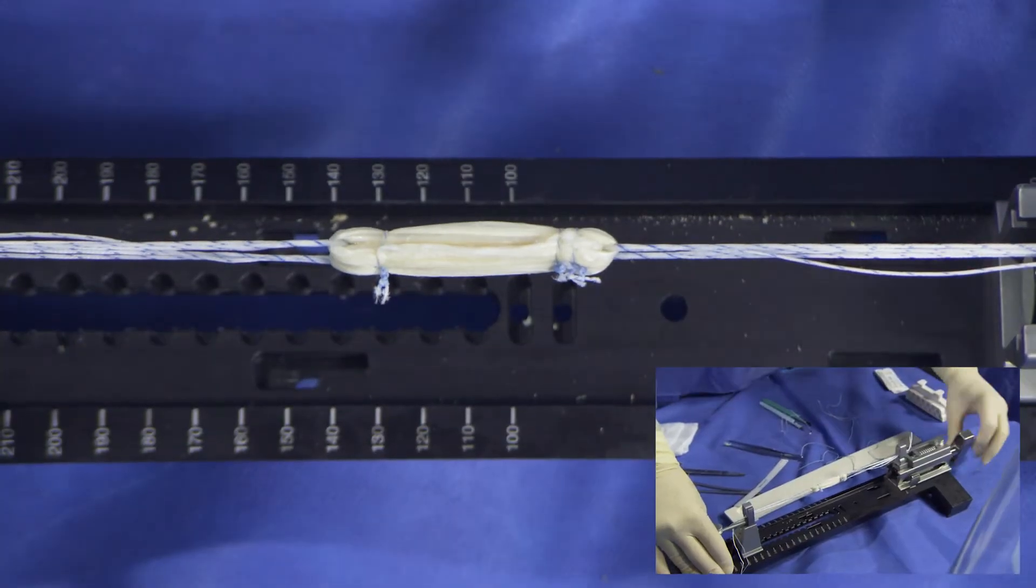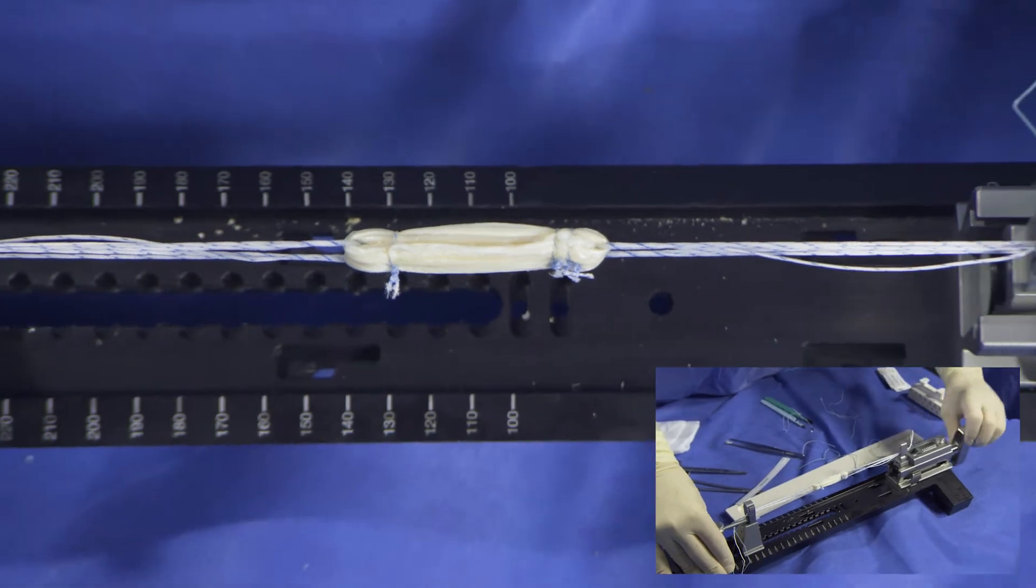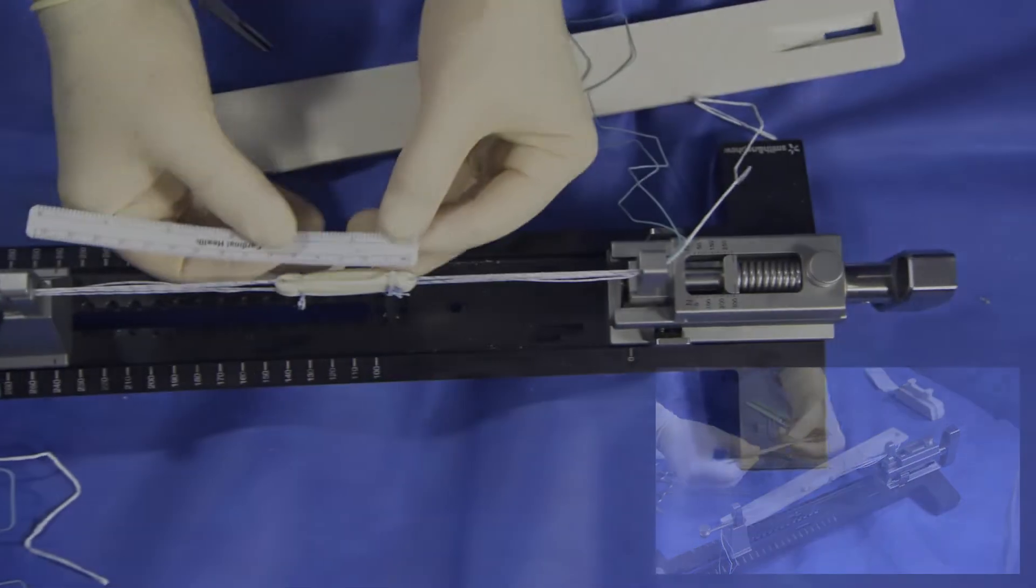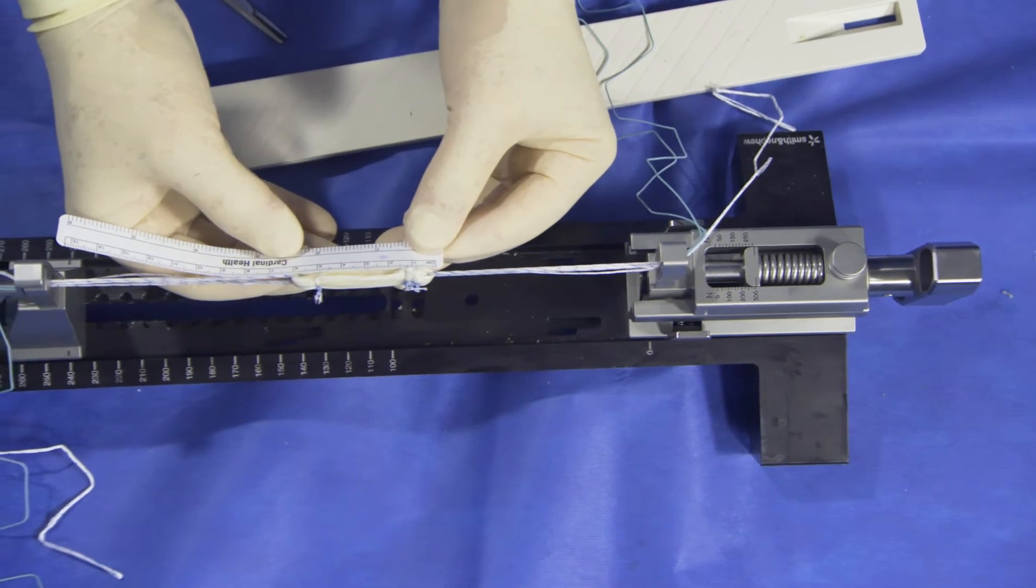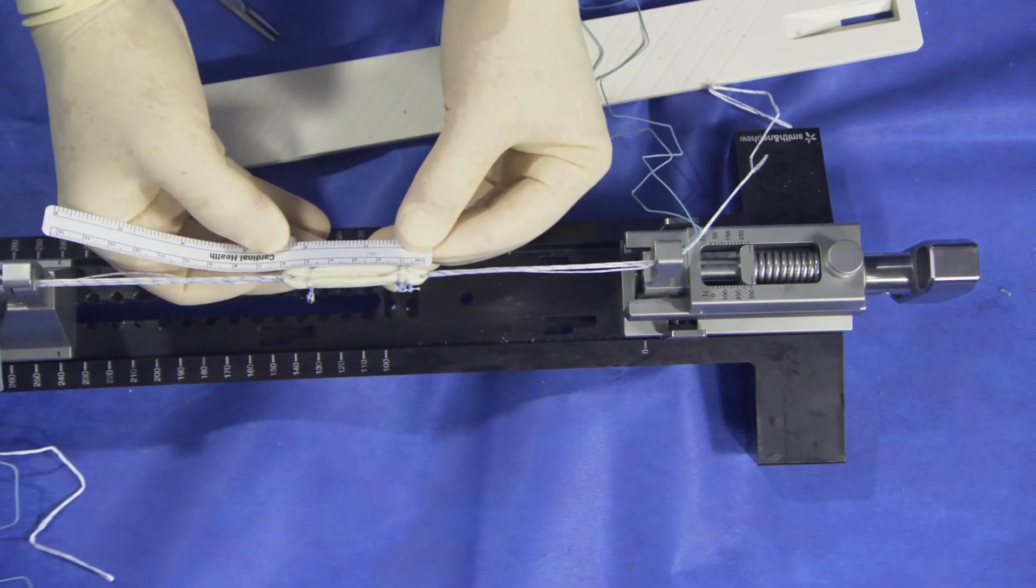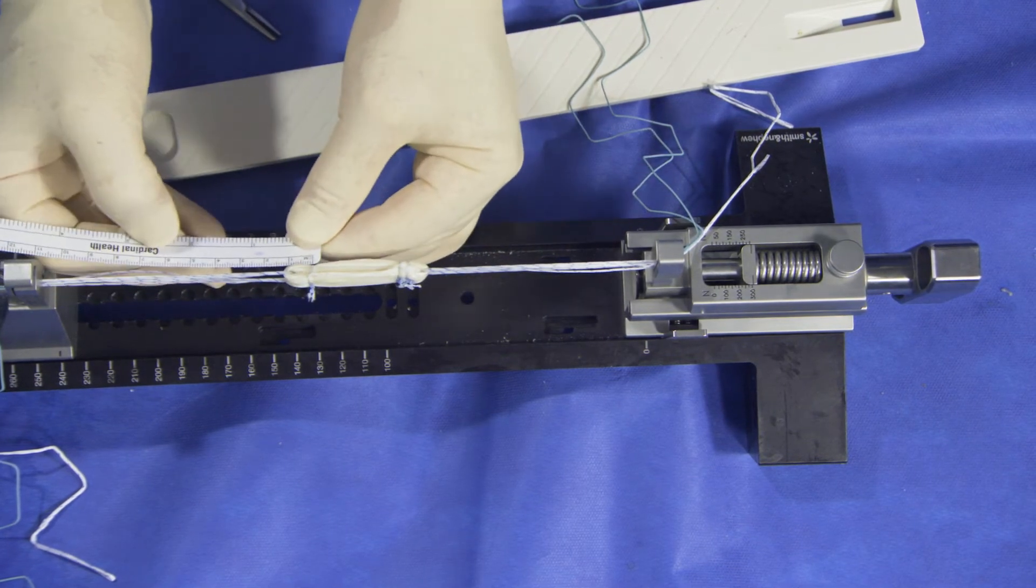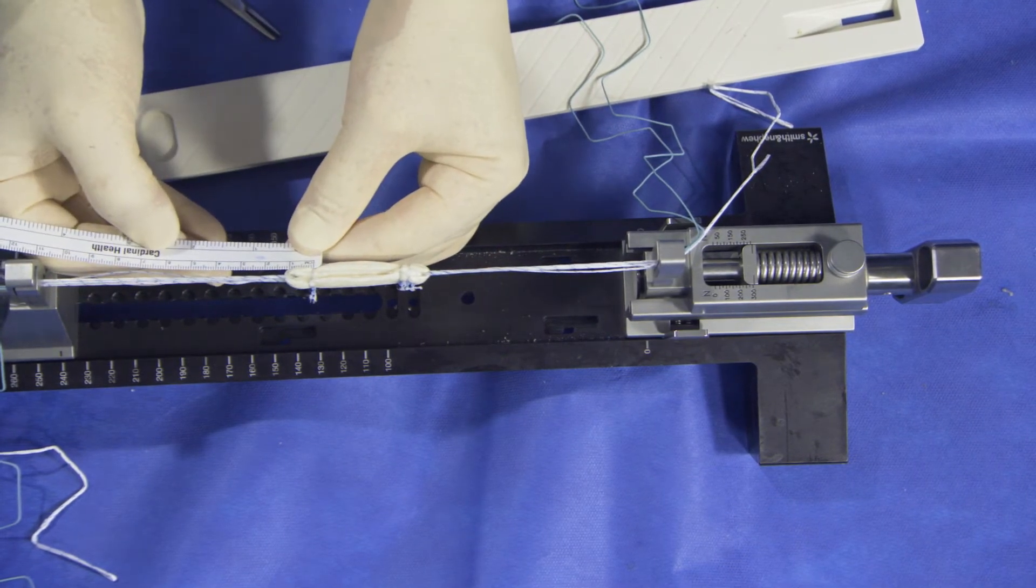Tension is then added to the graft up to 300 newtons for one minute to remove laxity of the interfaces that can occur with tension later on. The graft is then measured. This graft is 60 millimeters with approximately 12 millimeters for either end.